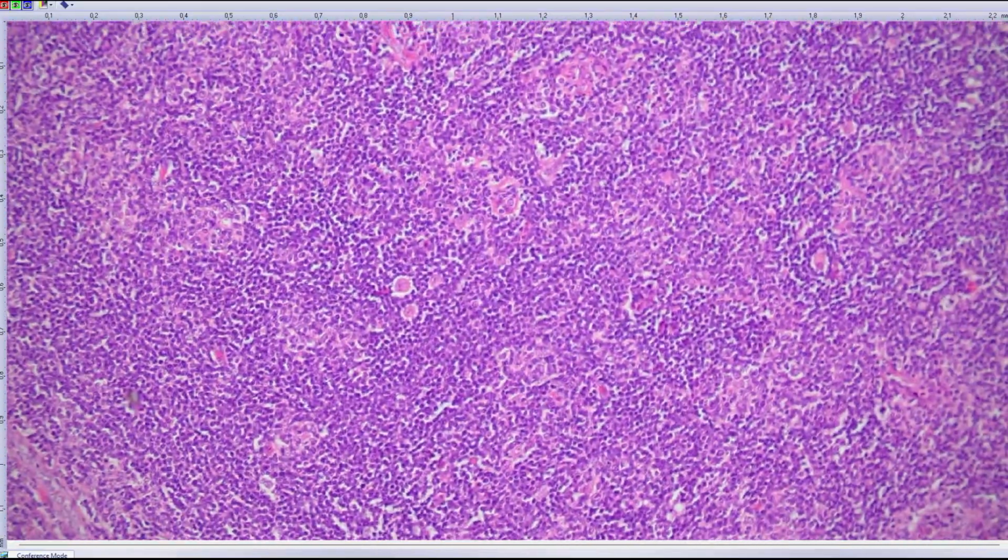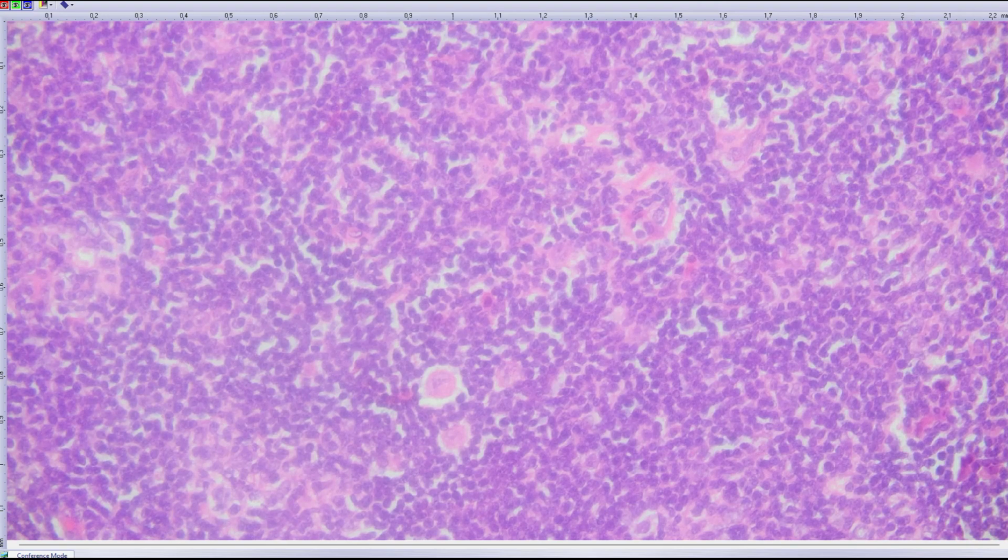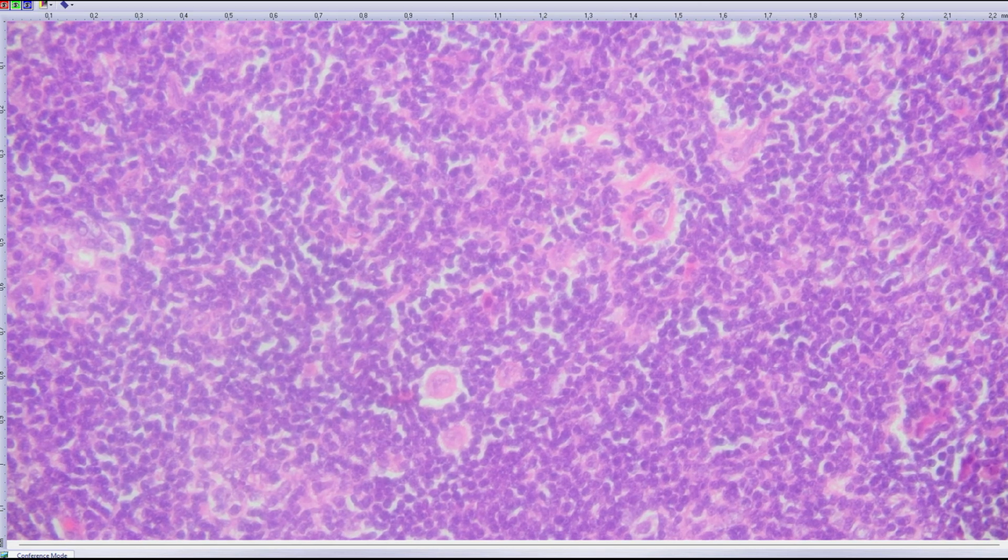You see these malignant cells here as well, they are very large. So this category of Hodgkin doesn't exist anymore. Yeah, some people still call it Hodgkin lymphoma, but last week I went to a course which was very focused on these, and all of the experts call it B-cell lymphoma. They have a complete B-cell program, they are positive for OCT2, CD20, CD79A, and they are negative for CD30 and CD15, which is otherwise typical for Hodgkin lymphoma.